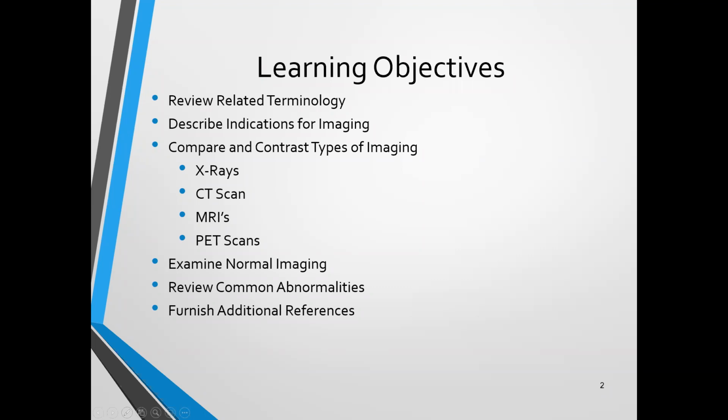We'll spend a little bit of time comparing and contrasting the types of imaging. Now, the bulk of this presentation is indeed on x-rays, just to lay that out to start with. However, I would be remiss if I didn't do some compare and contrast, looking at x-rays versus CAT scans or CT scans, MRIs, and PET scans.